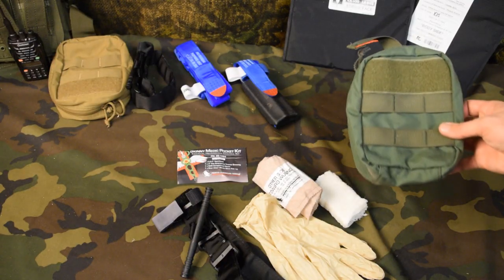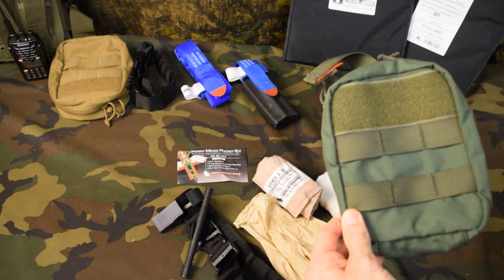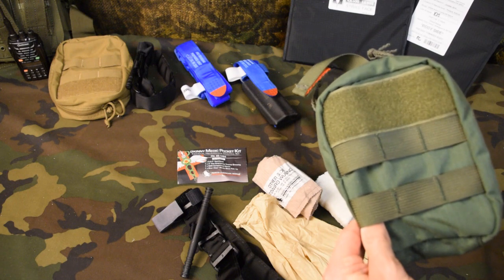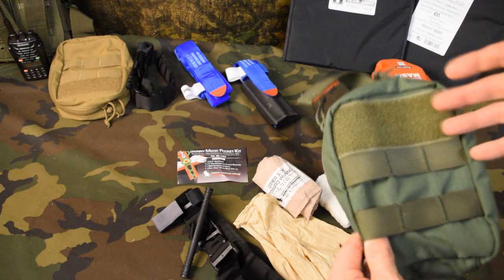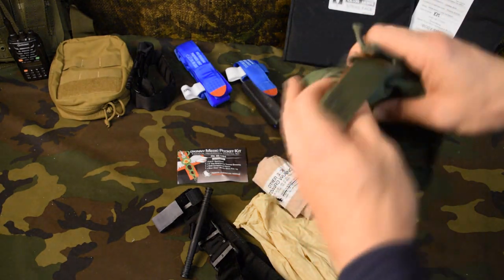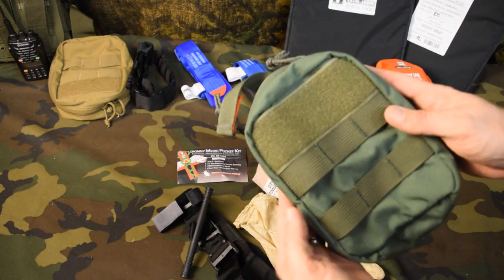Something else you could look at doing — let's say you have this tactical pouch here. It matches everything else you have. You just need the supplies to go in it. You could buy the Skinny Medic Pocket Kit, open it up, put all the supplies in the pouch, and you have a trauma kit ready to go.